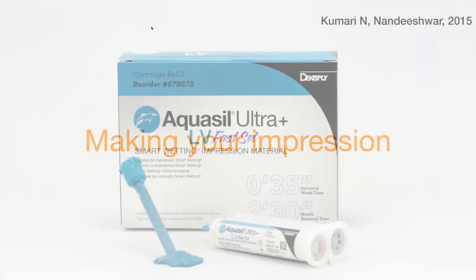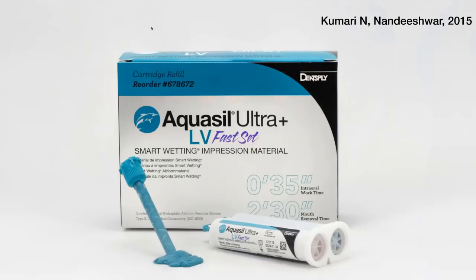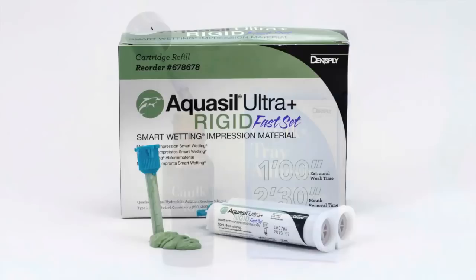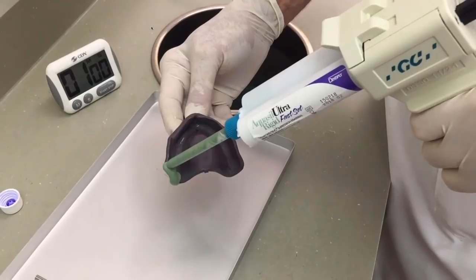I like Dentsply Sirona's Aquasil Ultra Plus LV Fast Set — it sets in two and a half minutes, which is a big deal for me, and I like the various viscosities it comes in. First, paint tray adhesive appropriate for the material you're using — this is a PVS tray adhesive appropriate for the Aquasil. Then I use Aquasil Ultra Plus Rigid Fast Set, a thick viscosity material that works very well for border molding the tray. Apply material all the way around the edges and some in the middle.